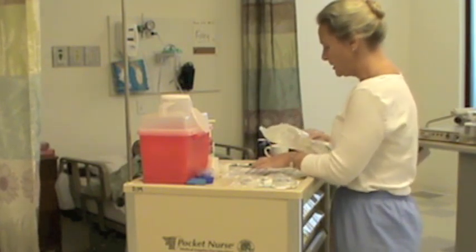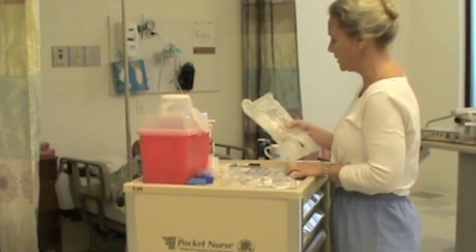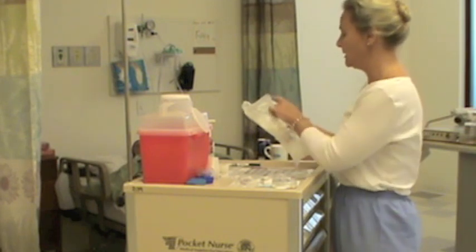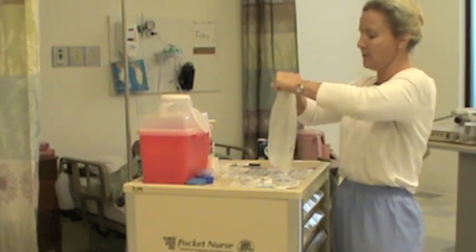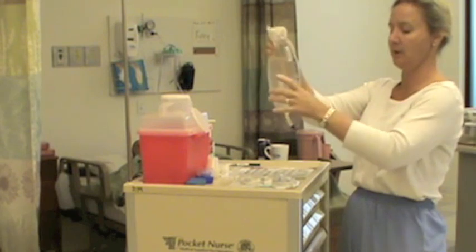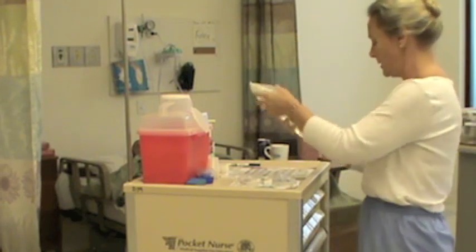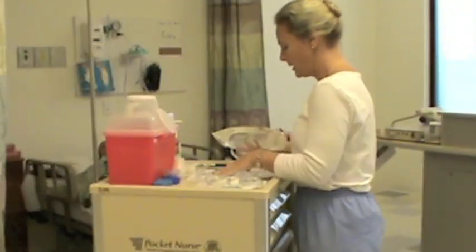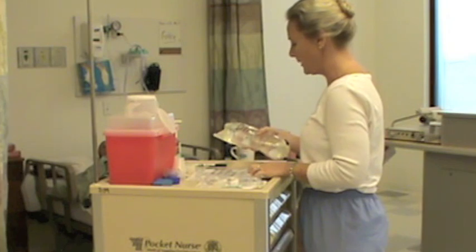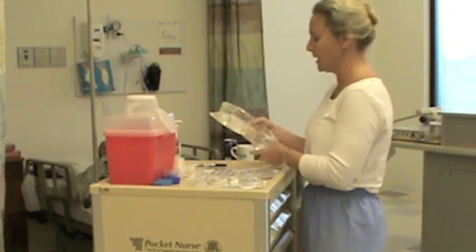I'm going to check it again: Hoshi Ito, correct medical record number, date of birth. He's allergic to morphine — no morphine here. I'm giving 1 liter of 0.9% sodium chloride at 125 mL per hour. I'll calculate the drops per minute and confirm it is not expired. Now I'll open it and verify it's not leaking or punctured, not cloudy, no precipitates — it's clear and colorless. Third check: Hoshi Ito, date of birth, allergic to morphine, 0.9% sodium chloride, 1,000 mL, 125 mL per hour, not expired, times 3 liters. This will be his second bag.